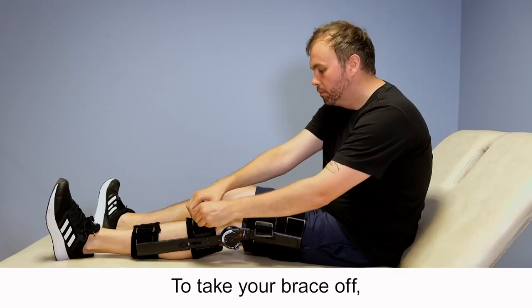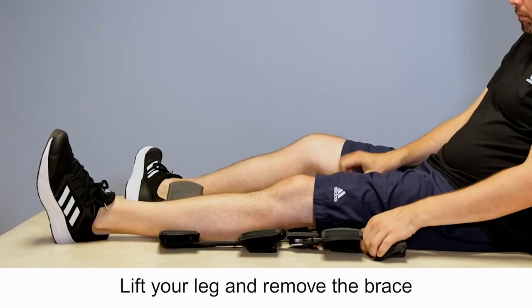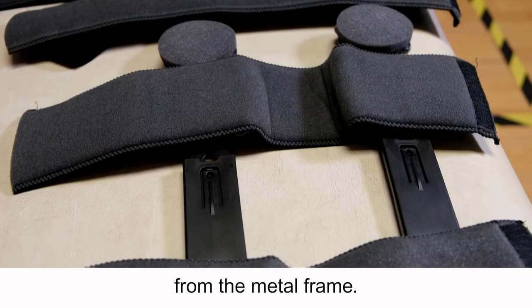To take your brace off, undo all of the velcro straps and the velcro padded straps. Lift your leg and remove the brace from underneath your leg. Try not to remove the padded straps from the metal frame.